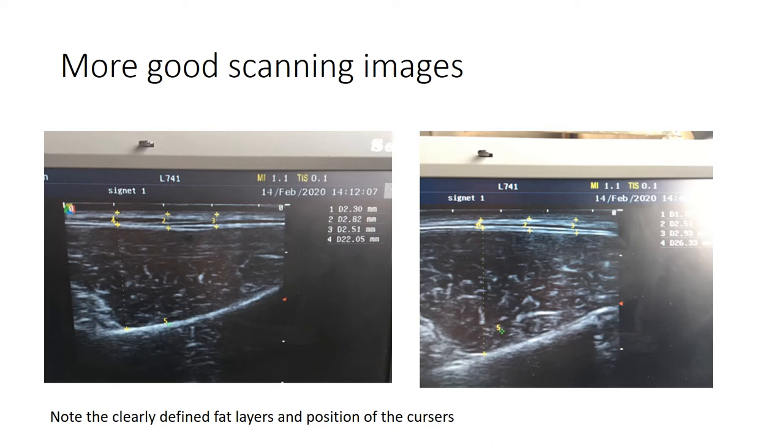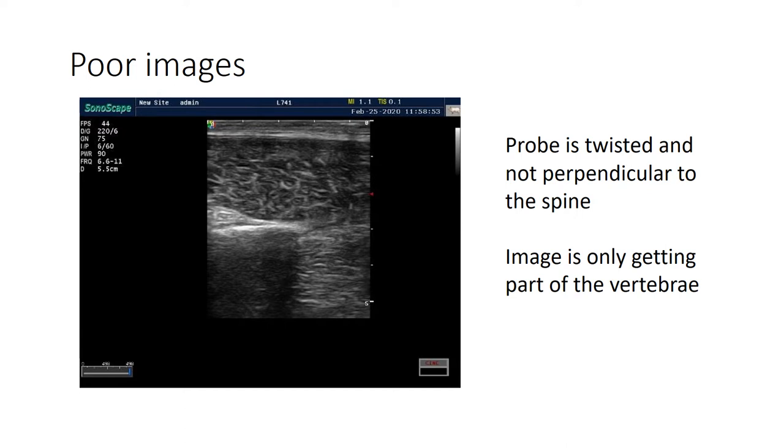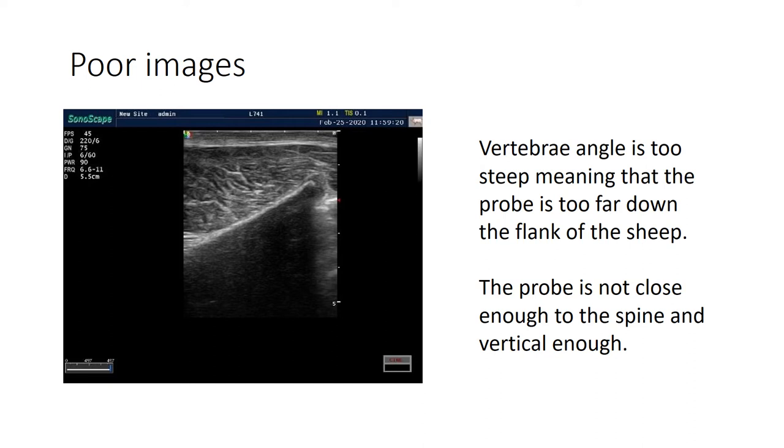Here are a couple more nice scanning images showing well-defined fat layers and cursor positions. Now let's look at a couple of poorer images. This first one shows a probe that isn't at right angles to the spine - it's got twisted when applied - so you're losing definition as you move away from the vertebrae. You just need to twist the probe slightly to get a clearer image across the whole of the bottom of that muscle.